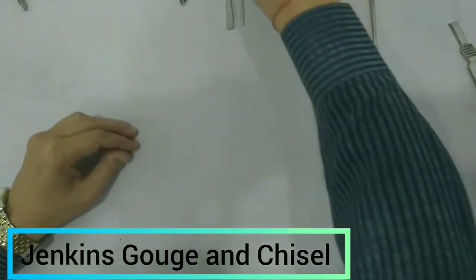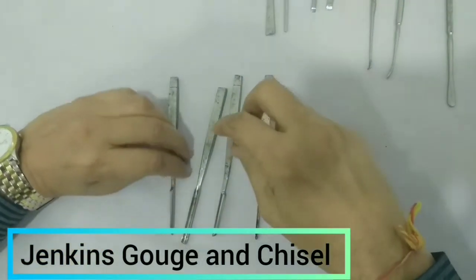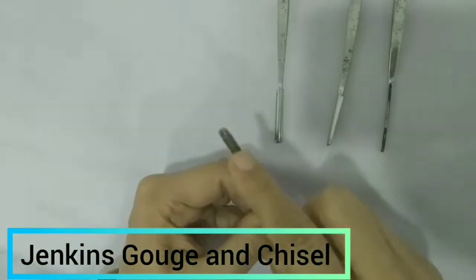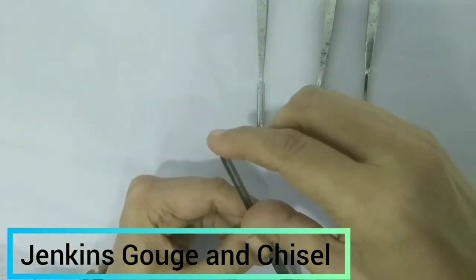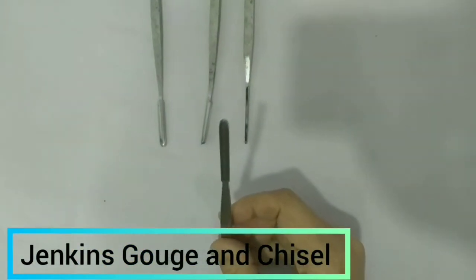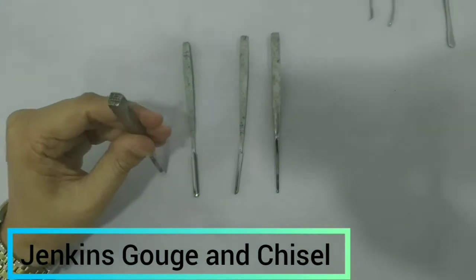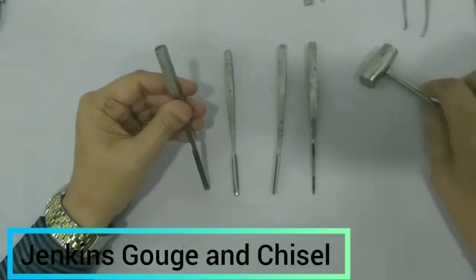Now these are the different sizes of gouges, and these are the chisels. In the gouges you can see this is little U-shaped and there is a groove in it. In the chisel there will not be any groove — the tip is flat and beveled. The gouge is used for removing bone — we place the instrument and use the hammer to strike over the head of the mastoid gouge to remove bone wherever needed.